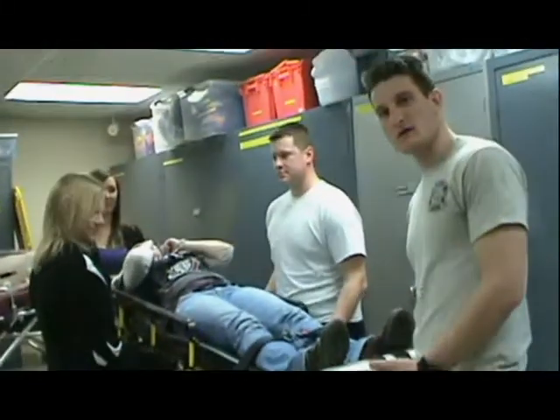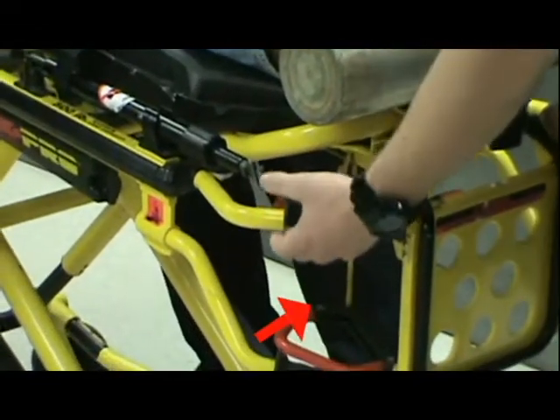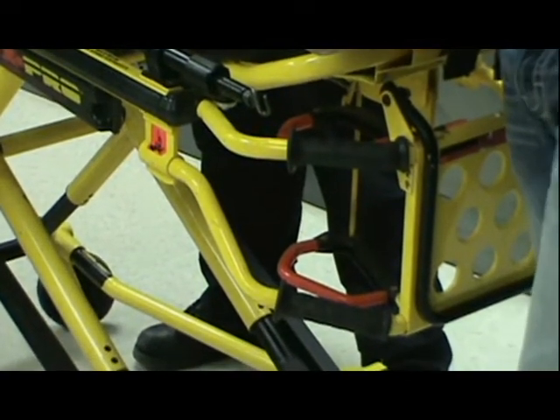To lower this cot, you have to lift it up and grasp the handle, then lower and let go of the handle to catch the notch so that it stops lowering.